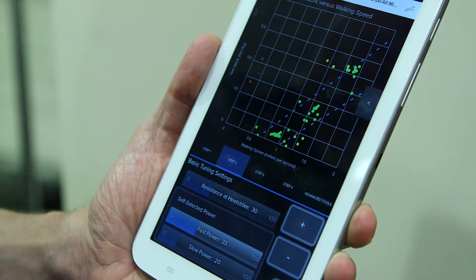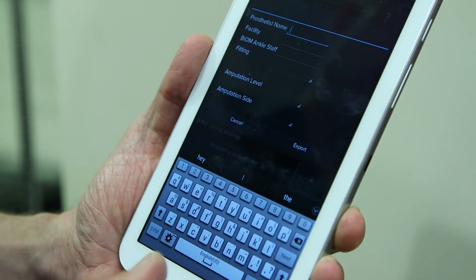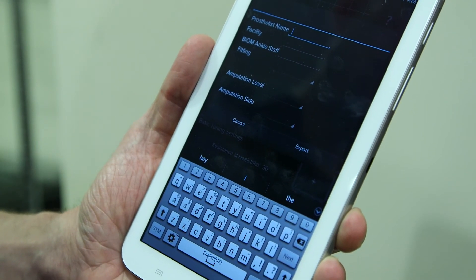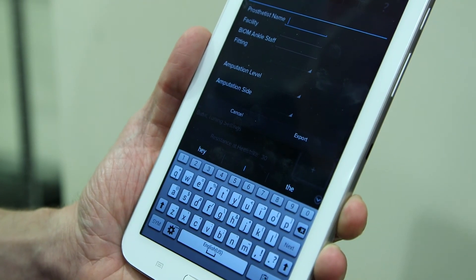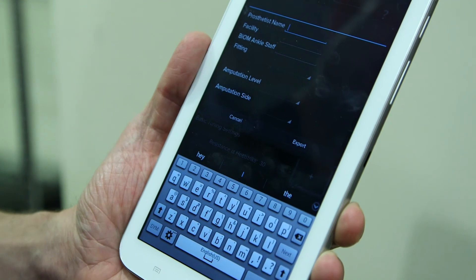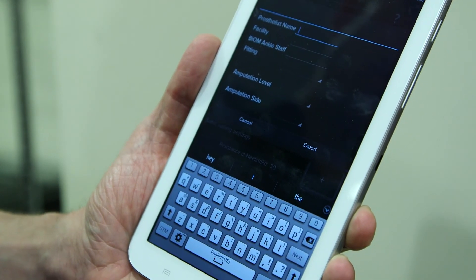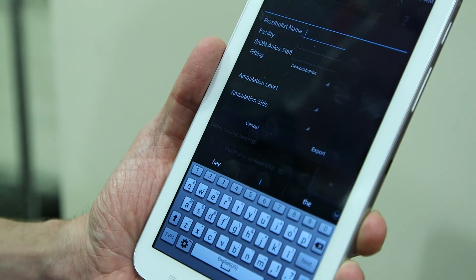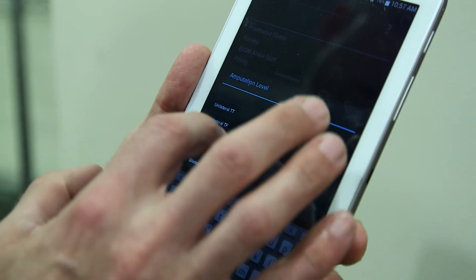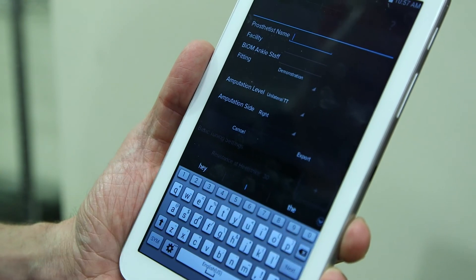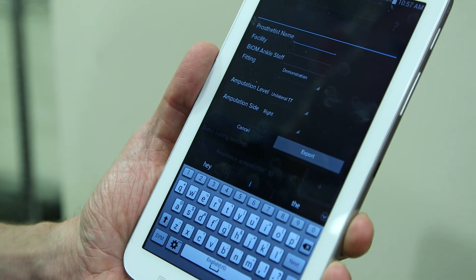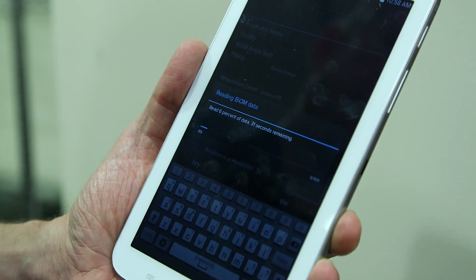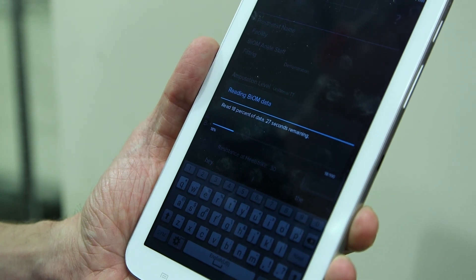At this point, I'm going to ask the patient to stop walking. I'll bring the menu back out and stop the recording. Once you stop the recording, it will ask you a series of questions to complete the tuning record. We start with the attending prosthetist's name, the facility that the patient is being fit at, and then a series of questions that will help us establish the tuning record, such as the type of fitting it is. This will give you options. In this case, we could call this a demonstration. The amputation level, in Ryan's case, he's a unilateral trans-tibial. He is a right amputee. Once we've filled in all of these fields, we simply hit export. It will take about 30 seconds to a minute to upload that data to the tablet and convert it into a PDF file.